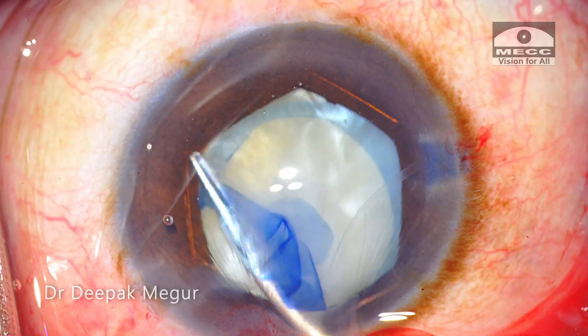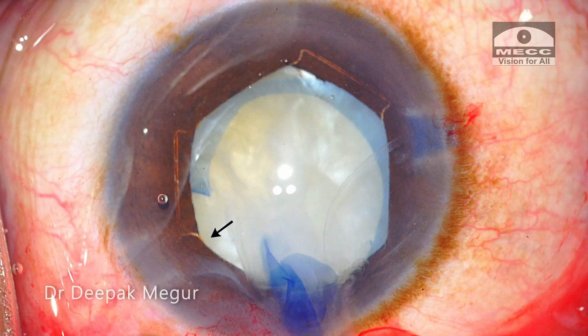Using micro scissors, I cut out the flap. This is the area where the rhexis has extended.